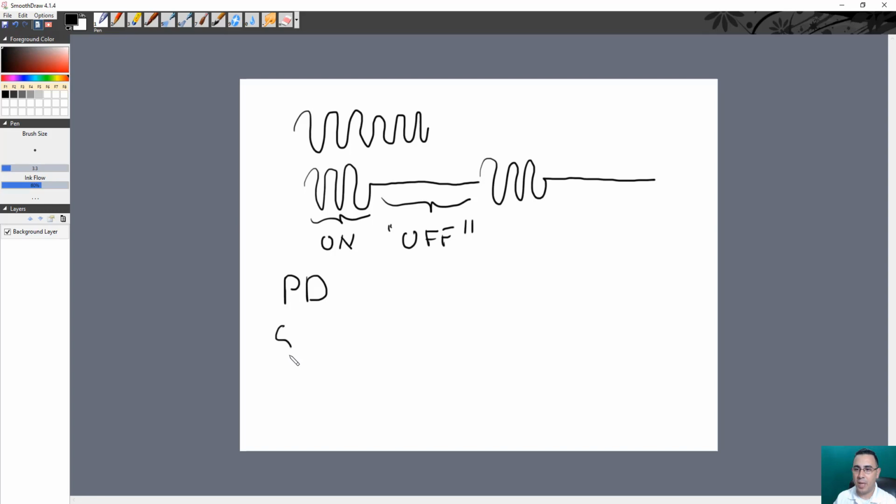And we have the spatial pulse length, which basically tells you how long the pulse is in the space. The pulse duration is easy to get: we get the number of cycles in the pulse times the period. That will give you how long this pulse is in time.